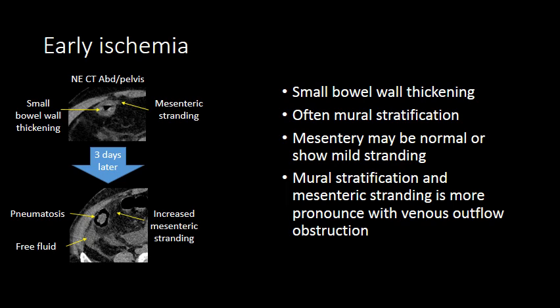As ischemia progresses from early to late, the bowel wall will often thin, become non-enhancing, and pneumatosis can develop. You may often see increased mesenteric stranding and free fluid. This case on the left-hand side of your screen shows a person who initially had small bowel wall thickening that progressed to small bowel wall thinning with pneumatosis.